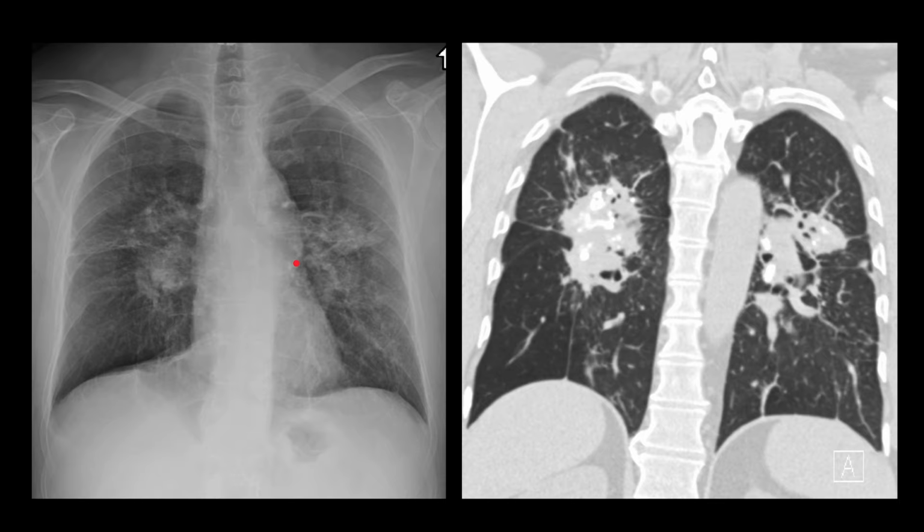They have sort of an irregular shape, and they're heterogeneous. There's some areas of high density within them. And then in the periphery of the lung, we have some reticulonodular opacities. On the CT, we see the masses again. We see the calcification within the masses, and it looks like there's architectural distortion and spiculation surrounding these masses. We also see tiny nodules at the periphery of the masses.